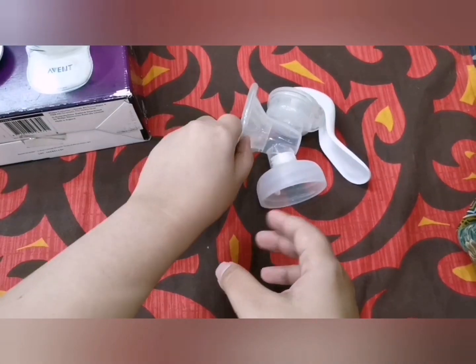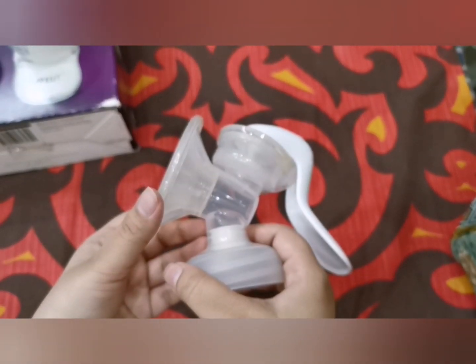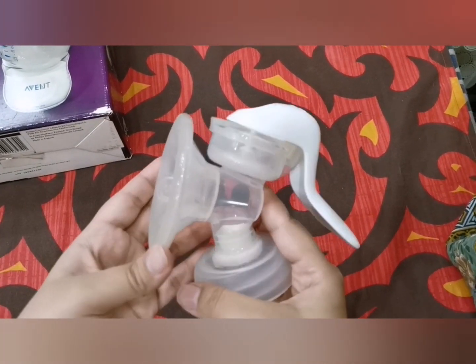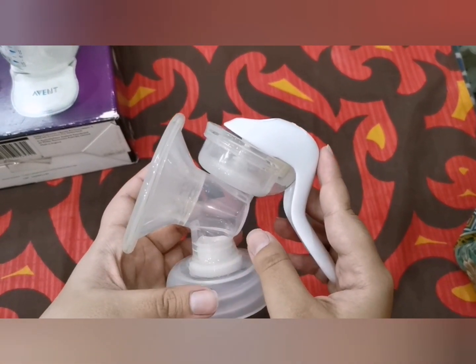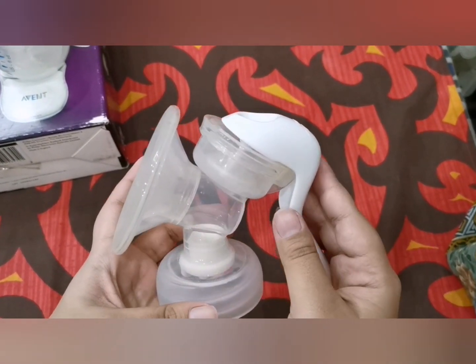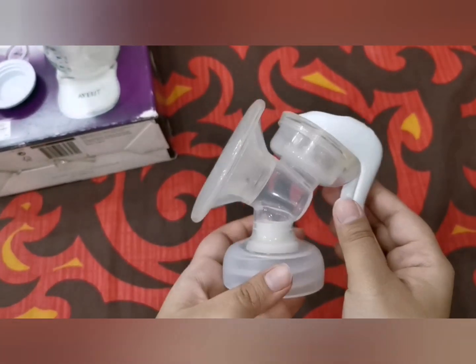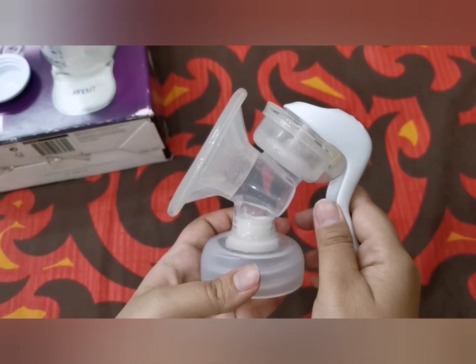For cleaning, you can use a soapy solution to wash the parts, or you can disassemble them and sterilize using the Philips sterilizer along with your Philips feeding bottles. If you don't have a sterilizer, you can place the parts in boiling water for a maximum of three to four minutes, which will be sufficient.